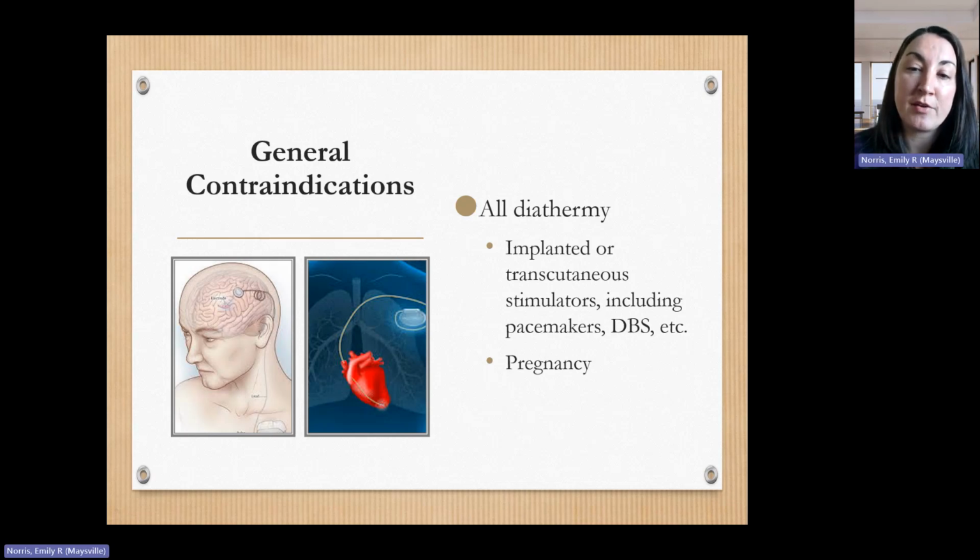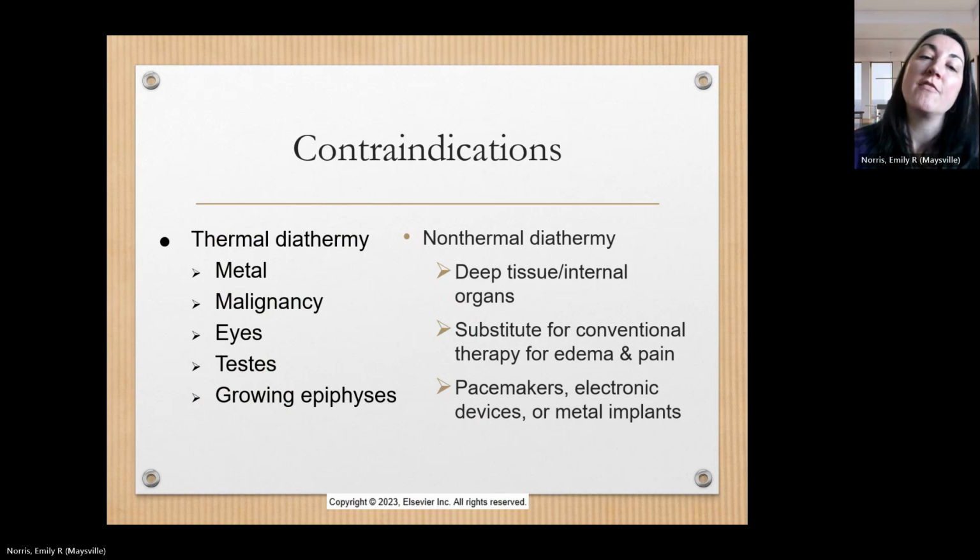Contraindications. All diathermies cannot be used over an implanted stimulator, such as a pacemaker or a deep brain stimulator. And they are contraindicated for anybody that is pregnant. For thermal diathermy, it's contraindicated to use over metal. Remember, metal heats up too fast.